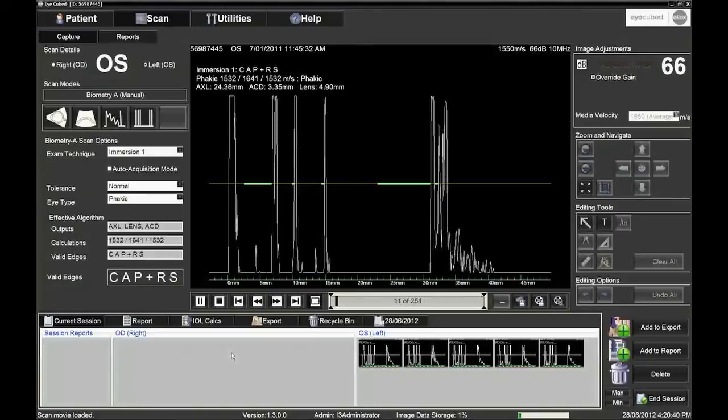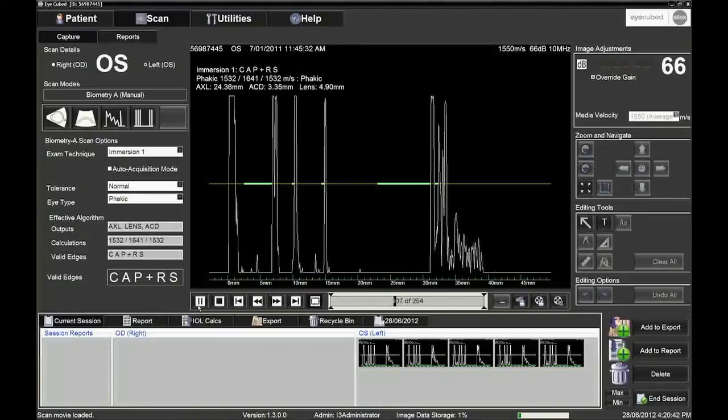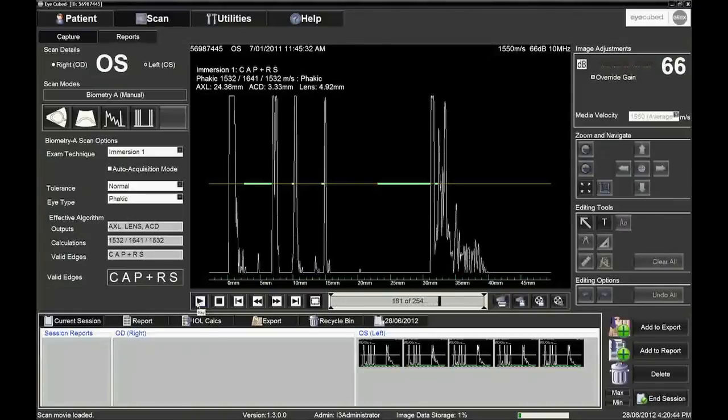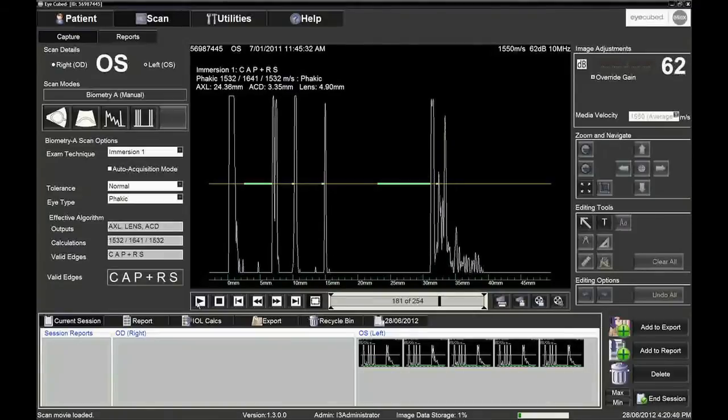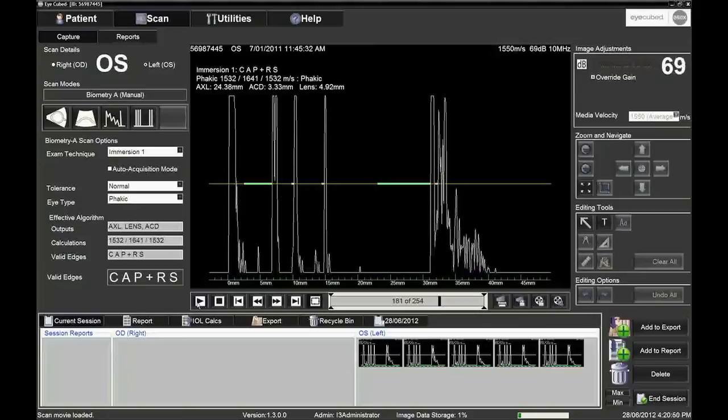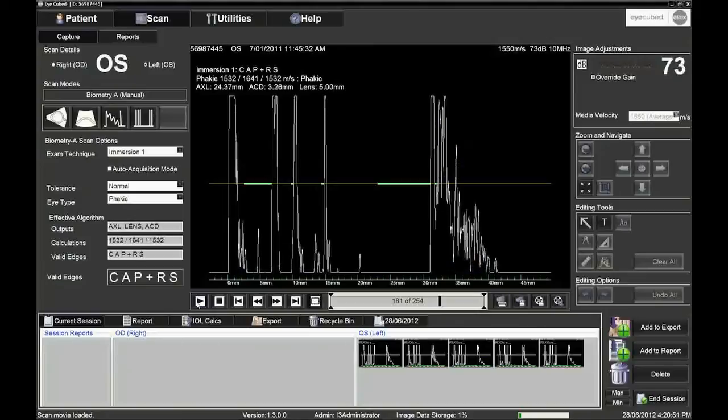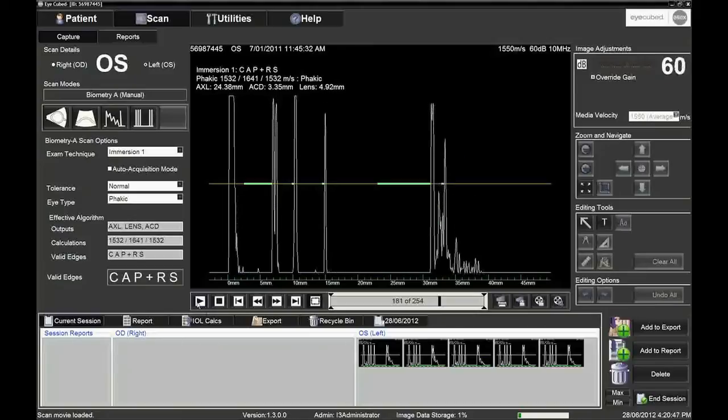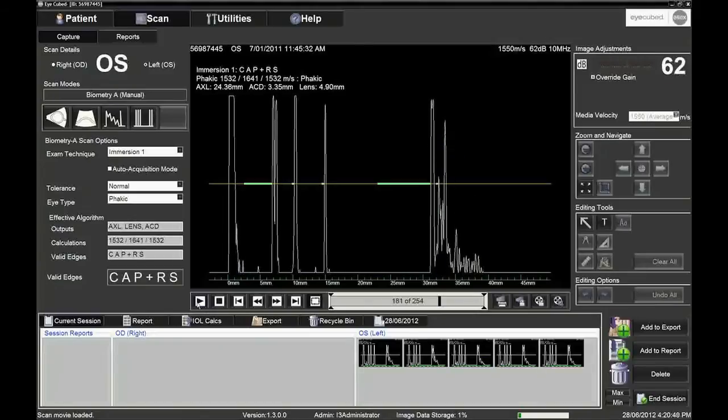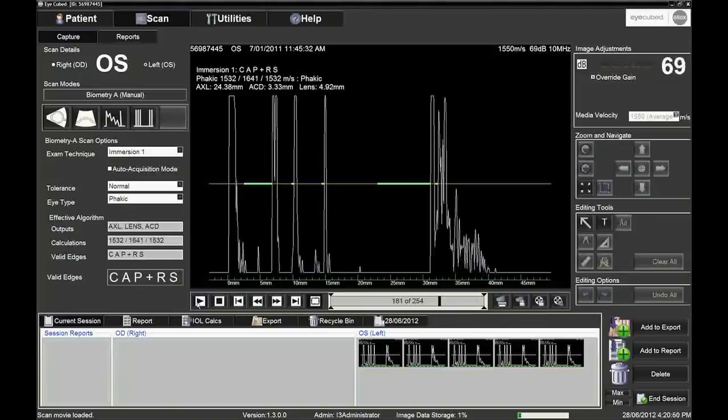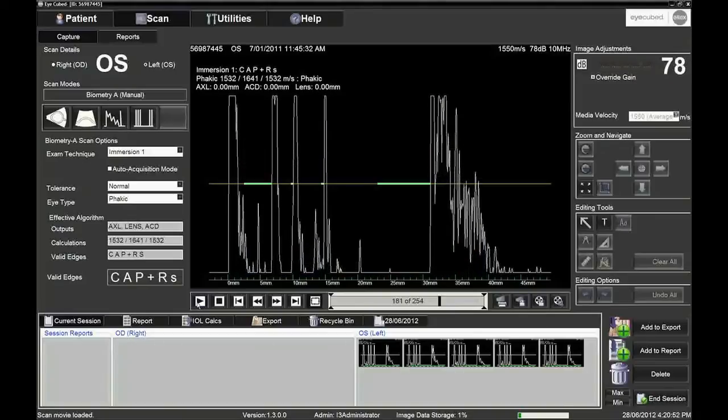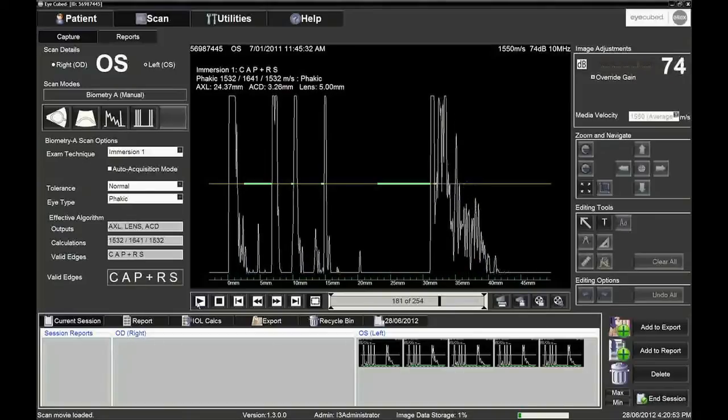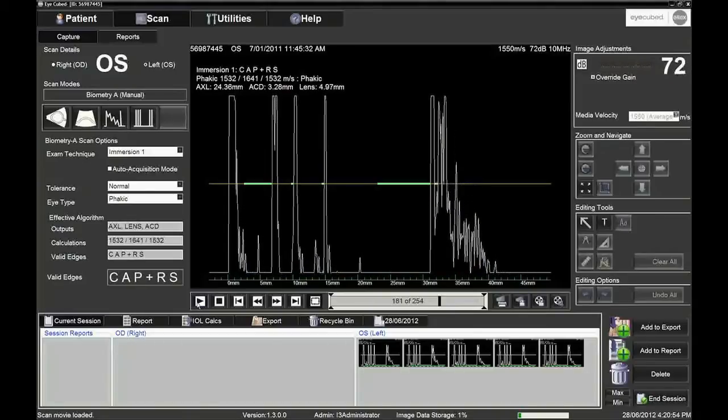In manual mode, it is possible to observe the image on the screen as you adjust the angle of the probe and ask the patient to look into the fixation light. A fixation target placed on the ceiling can help direct the patient's gaze. Adjust the gain so that the echo spikes reach the top of the screen but are not saturated.